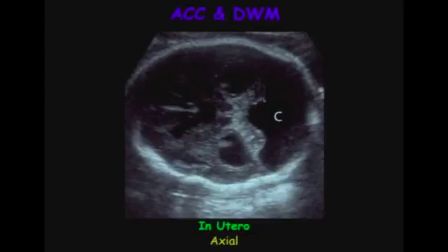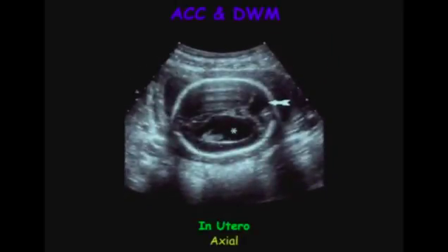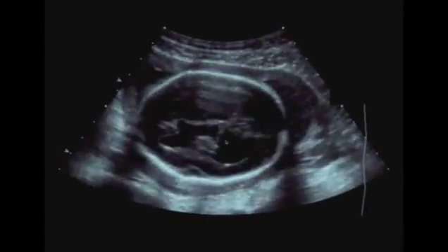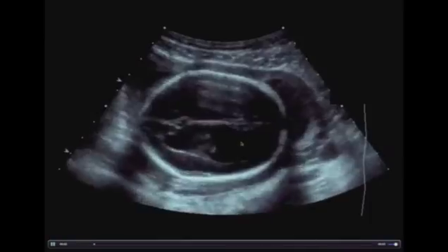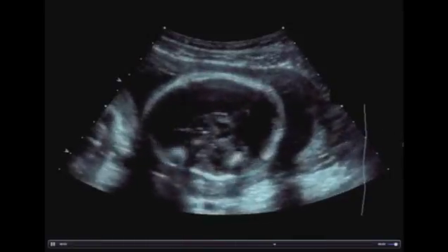Associated with lots of things, as we talked about. Here's a classic Dandy-Walker malformation. We heard a lot about this yesterday. Dandy-Walker malformation. And then we have fluid up here, but do you see the clear walls? No. Colpocephaly with marked ventriculomegaly. And then notice that even though we have fluid in front, we don't have the clear walls. And here's the video clip showing the Dandy-Walker variant, whatever they're going to call it nowadays, and nothing that's a true CSP anteriorly.